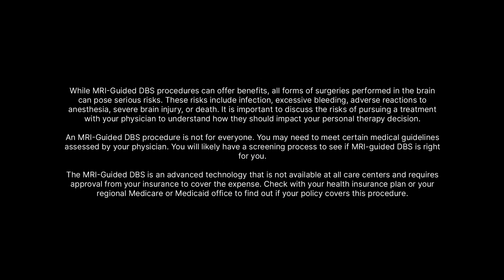While an MRI-guided DBS lead procedure can offer benefits, all forms of surgery can pose serious risks. An MRI-guided DBS lead placement procedure is not for everyone. You may need to meet certain medical criteria as assessed by your physician and complete a screening process. Ask your neurologist if an MRI-guided lead placement is right for you.